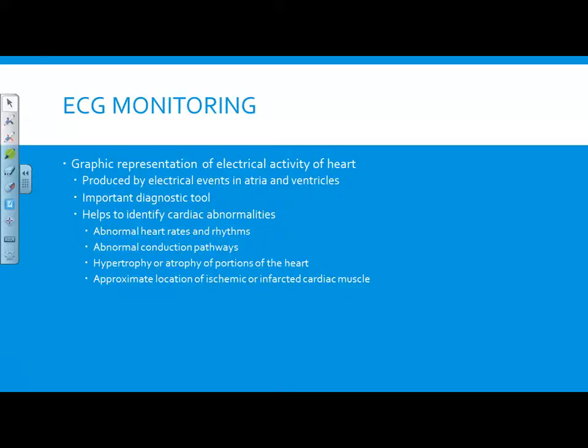It is a very important diagnostic tool. As a paramedic, any medical patient that you have and any big trauma patient that you have should get at least a basic strip run on them, in at least 2 leads. Okay? It will help you identify cardiac abnormalities in the electrical system. Now, based on your knowledge of how the electrical system works and what a complex looks like, you can expect what portion of the mechanical function is going to be affected.